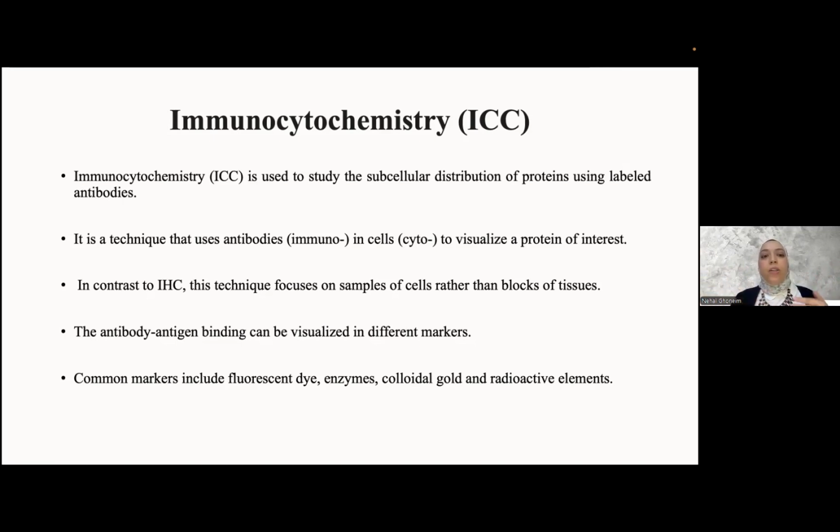Okay, the antigen-antibody reaction is visualized using different markers. Common markers include fluorescent dyes, enzymes, colloidal gold, or even radioactive elements.